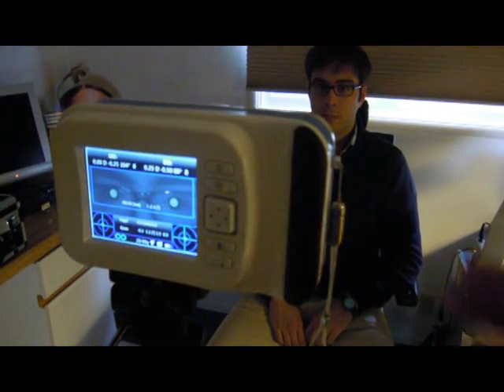For accurate over-refraction with glasses, you need to eliminate any reflections from the lens's surface. Slightly tilt the frames up to change the angle of the lenses.